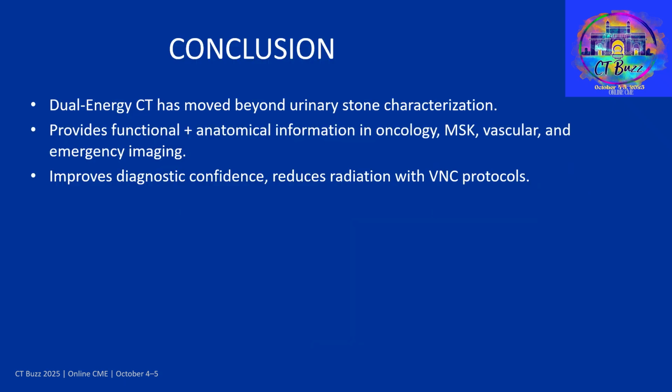In conclusion, dual energy CT is no longer limited to stone characterization. It provides both functional and anatomical information across multiple systems, improves diagnostic confidence, and reduces radiation exposure with VNC protocols.